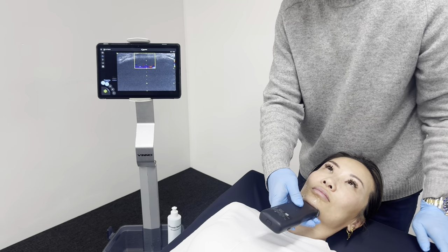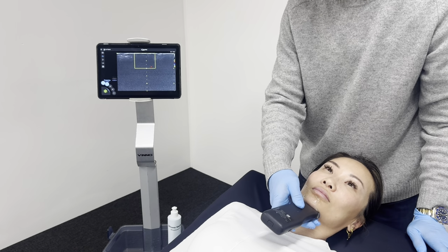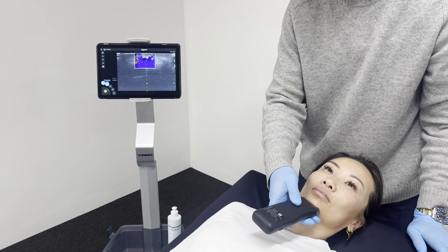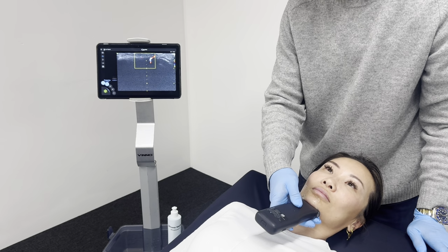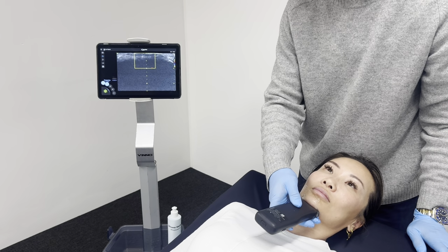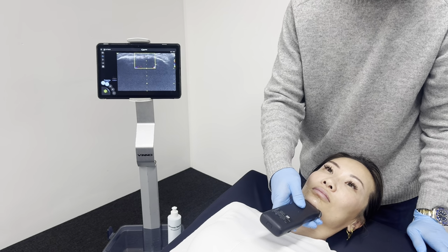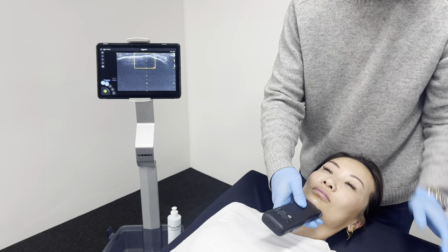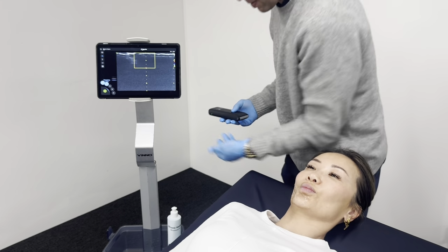I'm going to increase the colour gain. And just every now and then I was picking up that vessel just off to the side. There it is again. So I'll hold still there. And we can see just off the centre line, just by a fraction, we have that ascending mental artery. So I'll position that in the middle, and that's just probably a few mil to the left of centre. So that's the chin.